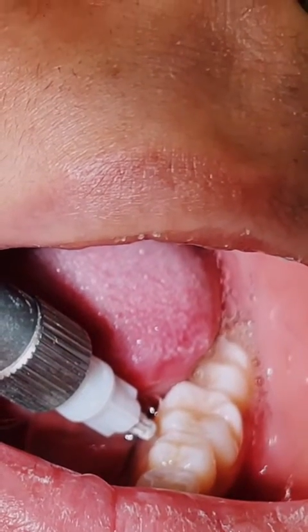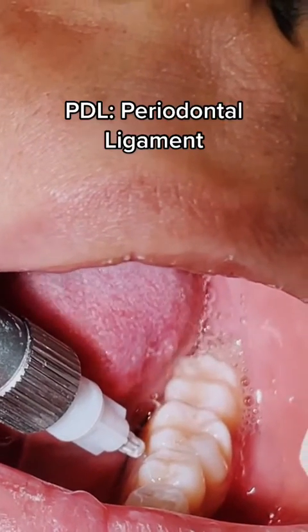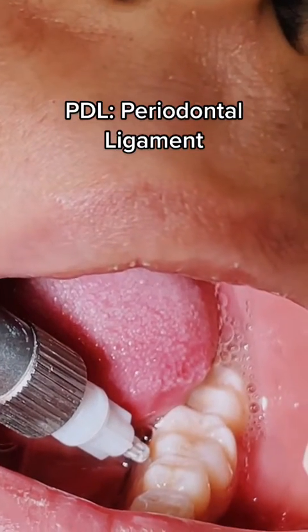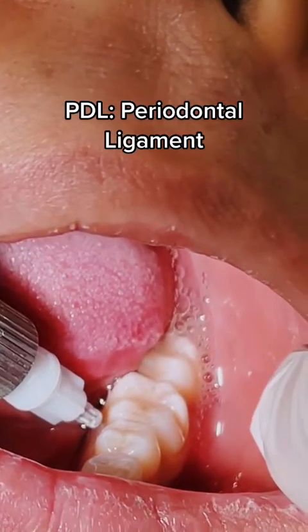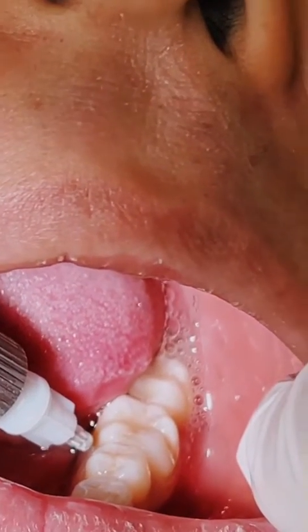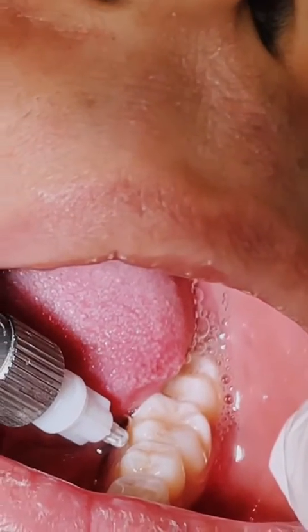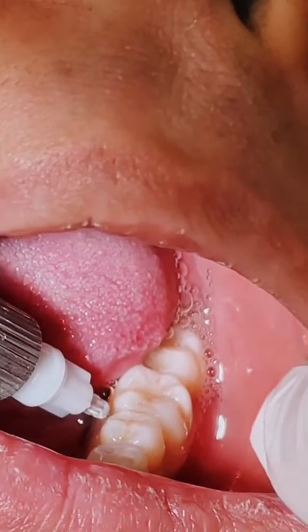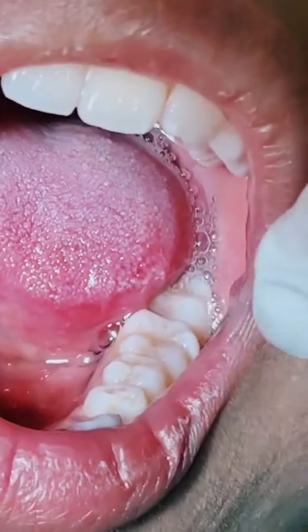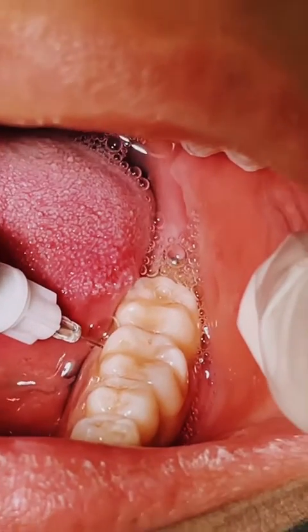Get a little bit more anesthetic in there, and once you get a little bit of anesthetic into the PDL you can go ahead and go a little deeper into the PDL and the inner proximal. Then they stop feeling it — you'll hear that click. Open. See how I'm able to get in there? I was in there pretty deep. I'm gonna go to the other side and drop a little bit.